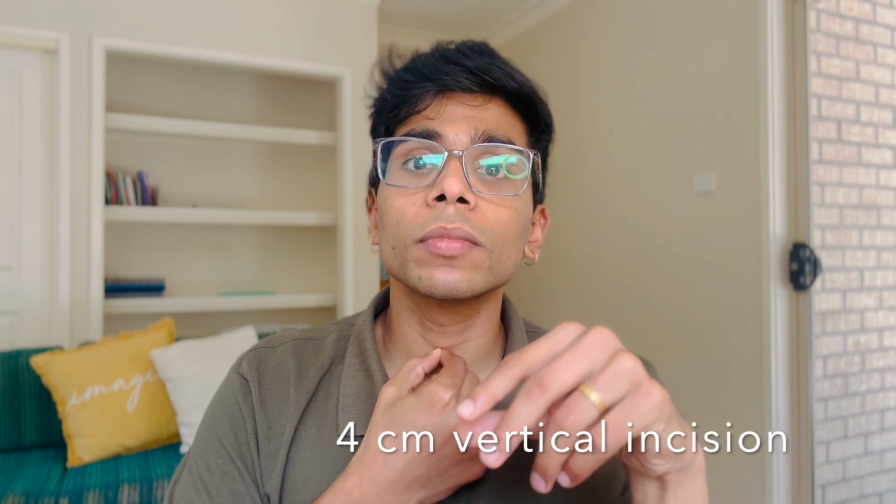So once the decision has been made to proceed with the cricothyrotomy, the first thing that you do is extend the neck to identify the anatomy. By extending the neck, you can identify the thyroid, the cricoid, and the cricothyroid membrane. Take your non-dominant hand, stabilize the trachea, and then with your dominant hand, make a 4 centimeter incision over the cricothyroid membrane. Note that this area might bleed a lot.